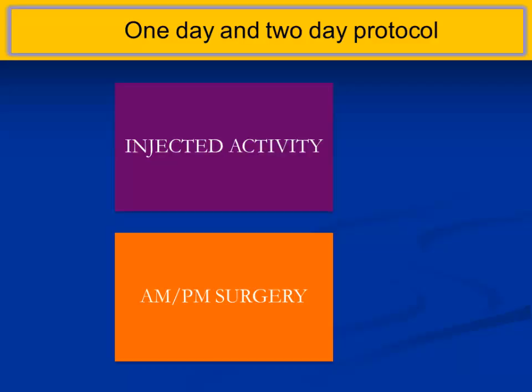Whereas if it's a melanoma, it is easy because you're injecting in the foot or in the limb. The drainage is quite longer. For example, if you inject in the thigh, the drainage is in the groin, so it is easy for the surgeons to use the probe. But if it's head and neck, it is quite challenging to use the probe where the primary site is close to the lymph nodes.